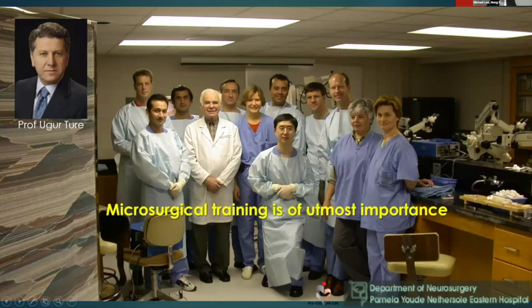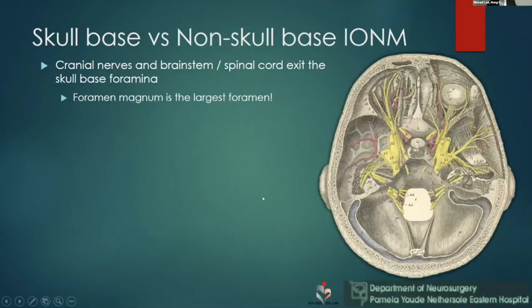All in all, for IOM, if you have good microsurgical training, then that is the most important thing. Without good microsurgery, you will always have the alarm going off during your surgery. It will be quite annoying, but it will be safe for the patient.